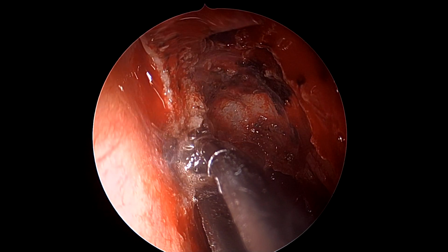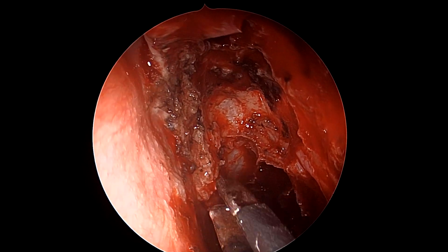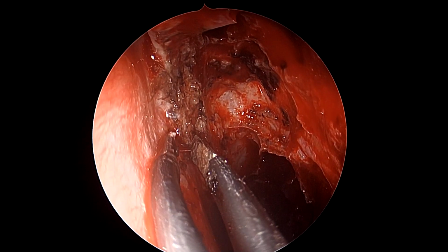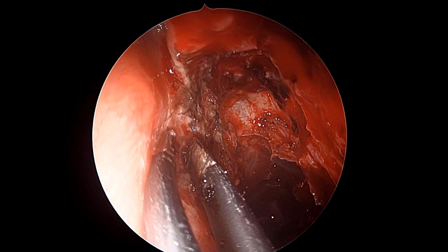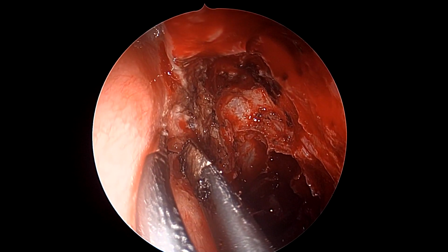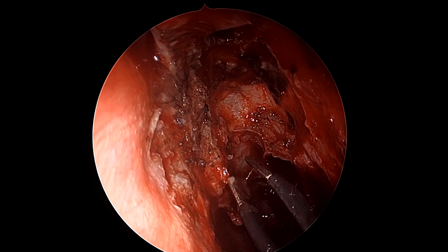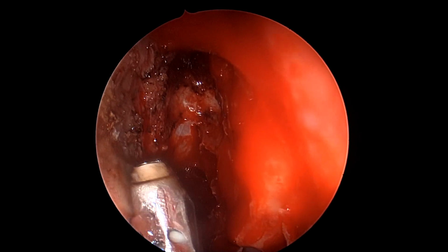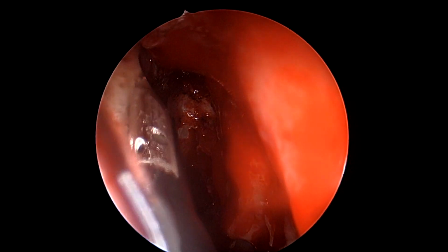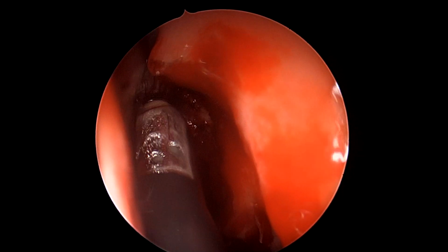Sometimes it also happens that once you have coagulated it and the meninges are no more protruding, it might become slightly even difficult to appreciate it. So one must have appropriate landmarks ready as to where the original site of defect was if one is not using the navigation probe. In large size defects, it's easier to identify, but smaller ones sometimes are very difficult to identify once you have removed a fair amount of bone and have ablated the meningocele sac.